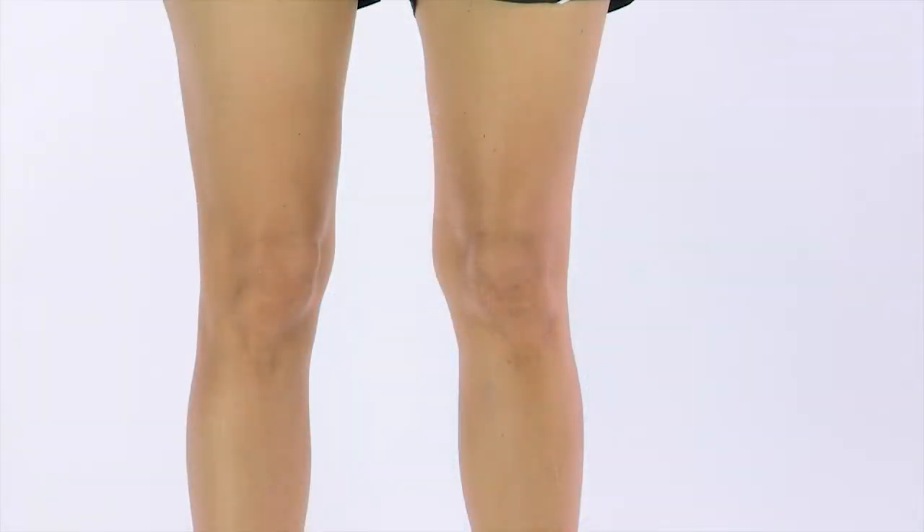The best way to do this is to stand with your legs shoulder-width apart, legs slightly bent with your muscles contracted.